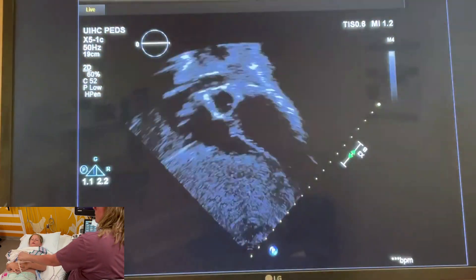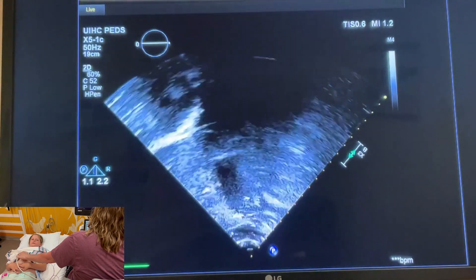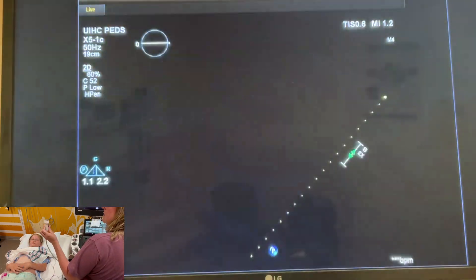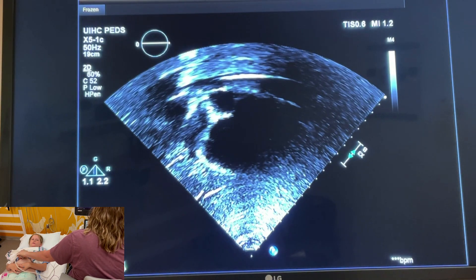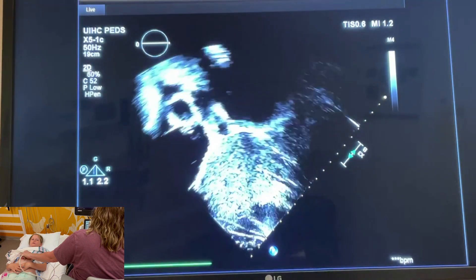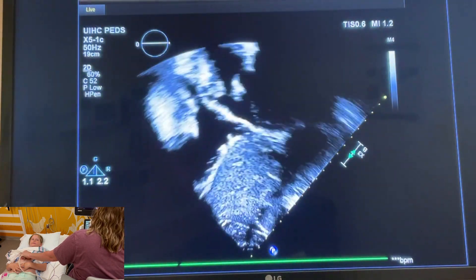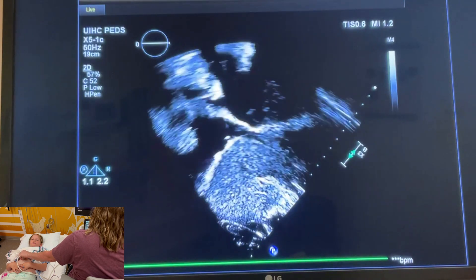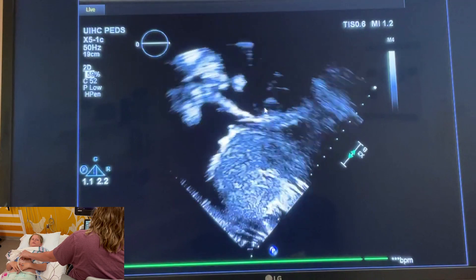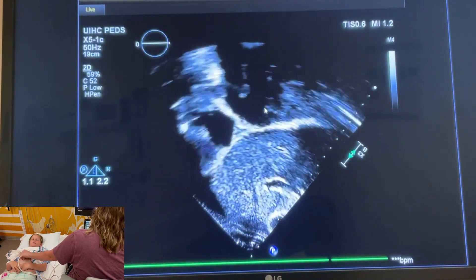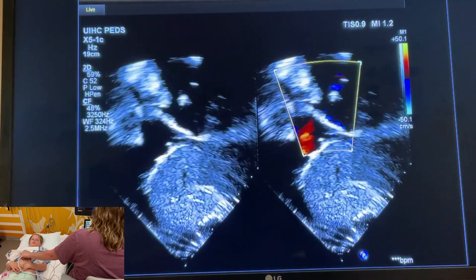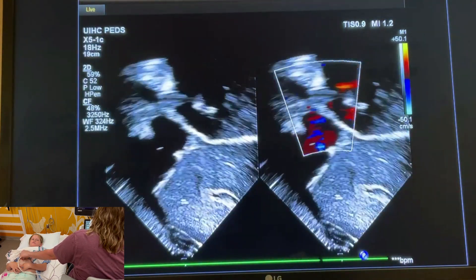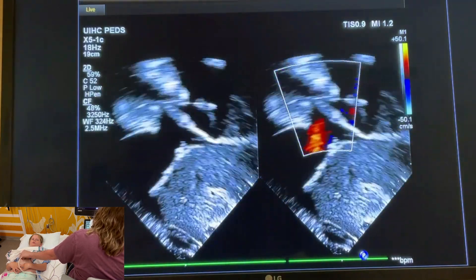Now that we've got our four chamber view, we look through the interatrial septum and we look through the ventricular septum — we do sweeps through both. We're looking for shunts, any lesions. Now I'm going to turn my transducer notch down to six o'clock and we're going to look for a bicaval view. The bicaval view is the IVC and SVC draining into the right atrium — here's SVC, IVC, right atrium, and the interatrial septum. We take a good bicaval view demonstrating correct drainage, then put a color box over the interatrial septum with a reduced scale because we're looking for low flow shunts, and sweep very slowly through the interatrial septum looking for any ASDs. Eleanor does not have any ASDs.